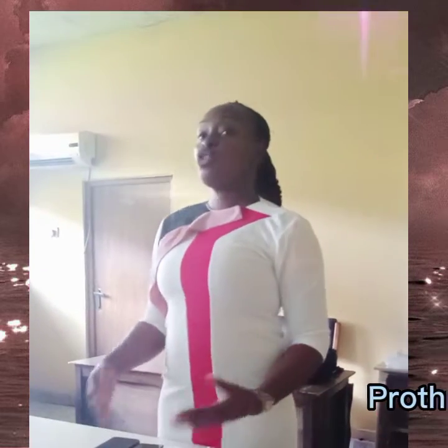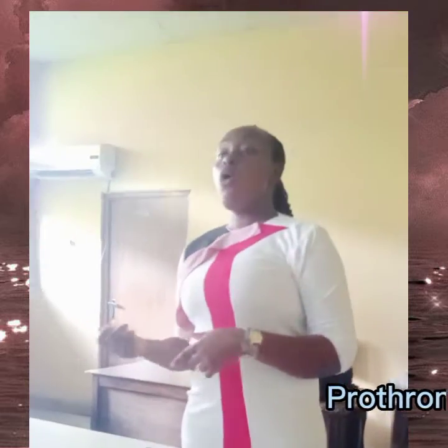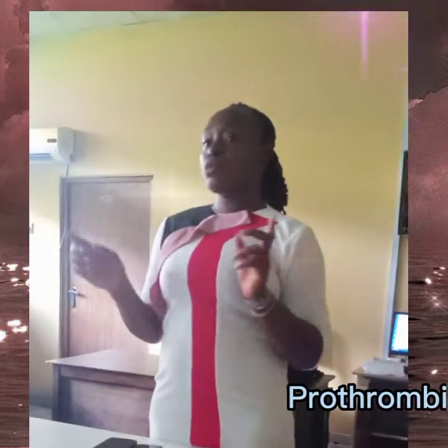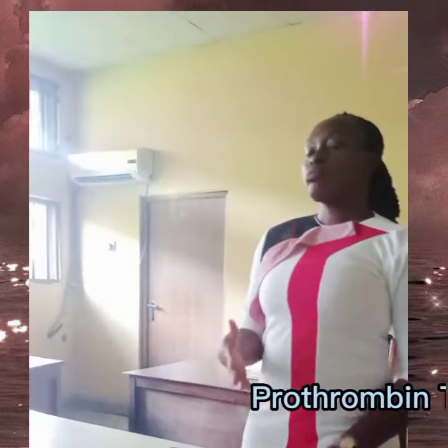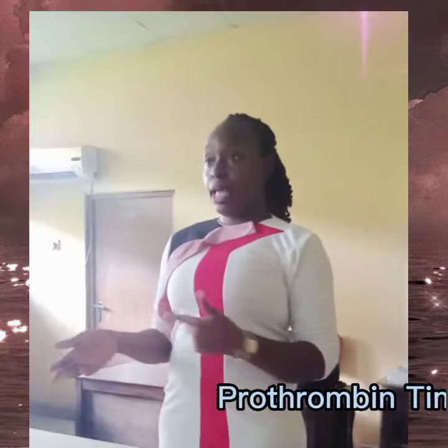Prothrombin is sometimes referred to as PT. It is a protein that is produced by the liver. So it is used to evaluate or screen for clotting time.